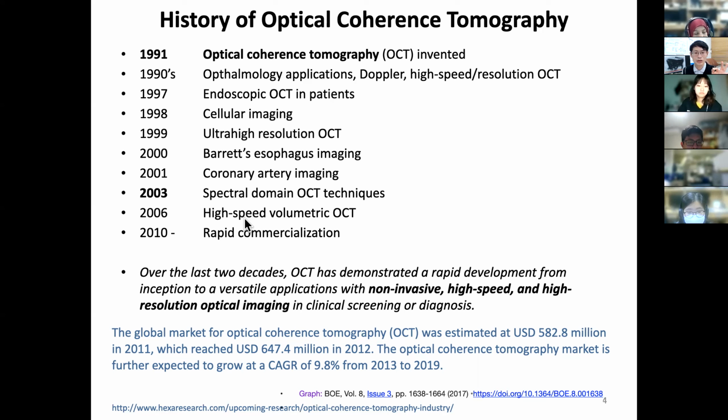So now what you can do is high-speed, not just frame images, volumetric OCT imaging, invented by Professor Seok-Hyun Yun, who is now at Harvard Medical School at Mass General Hospital, MGH. And then since 2010, there has been rapid commercialization.